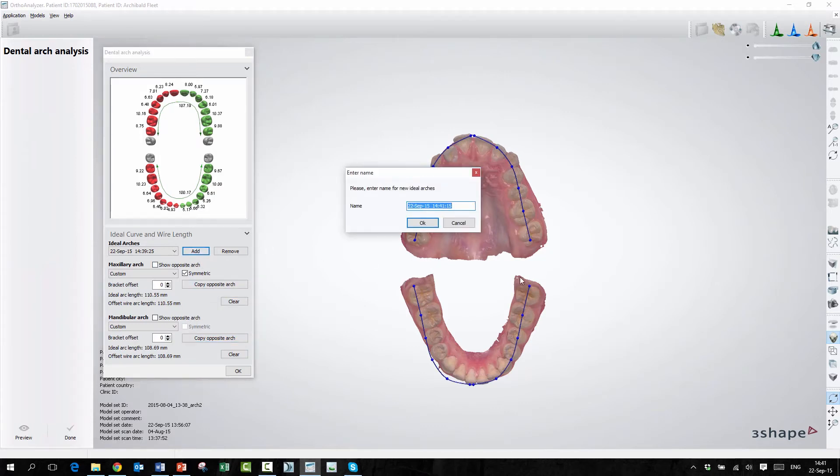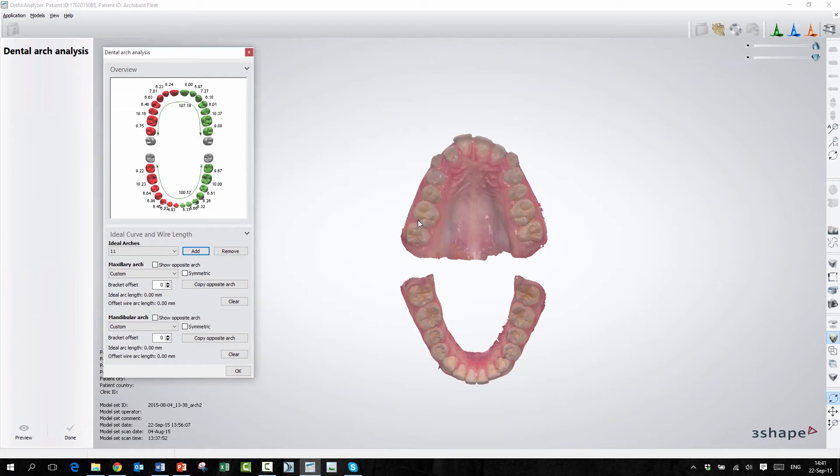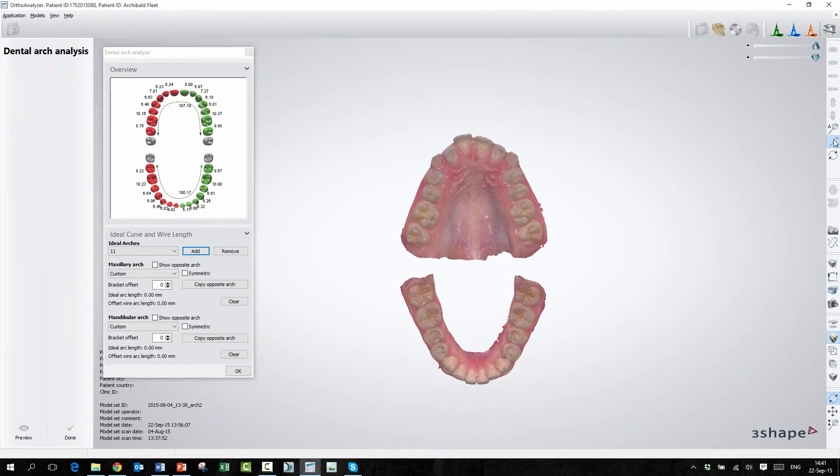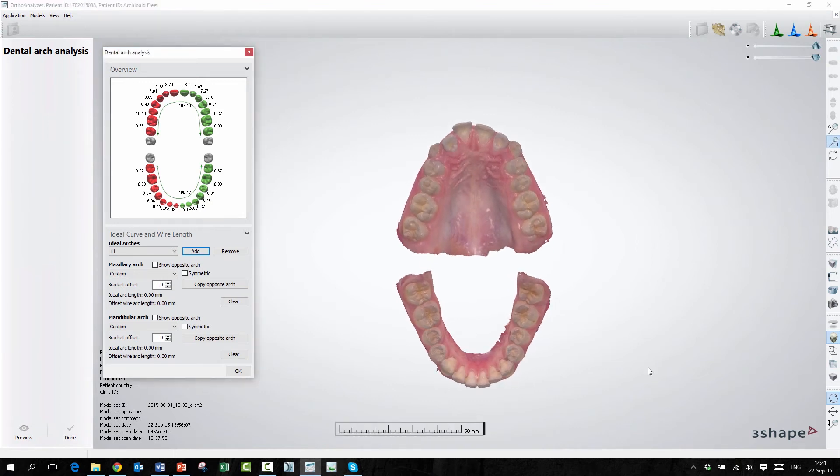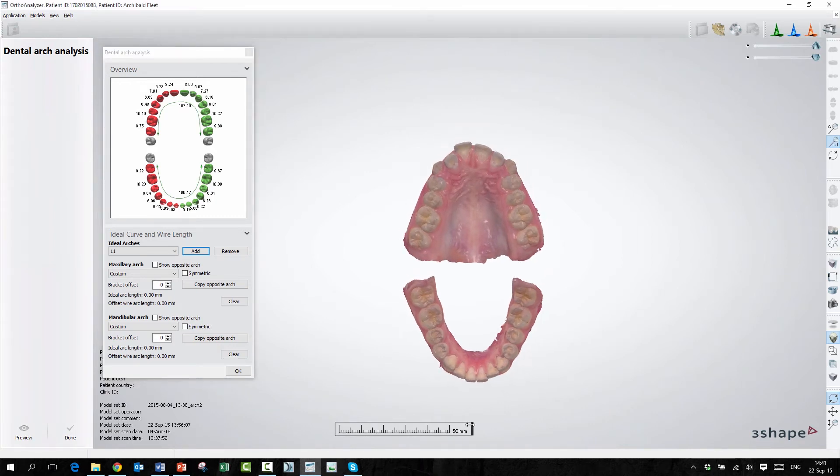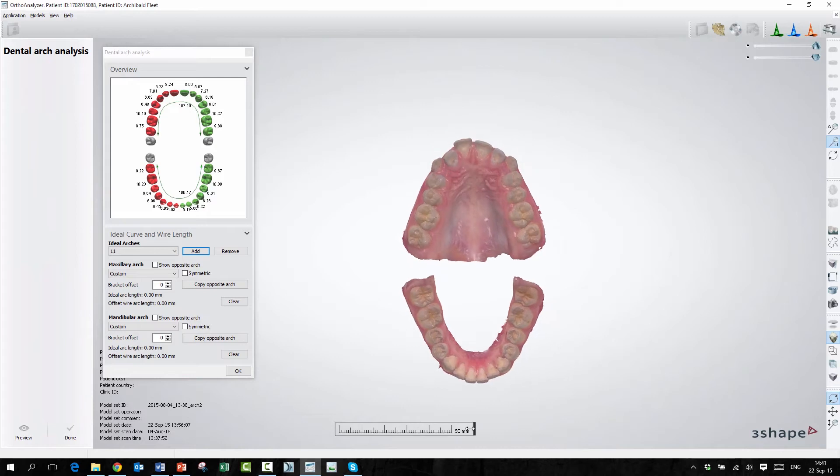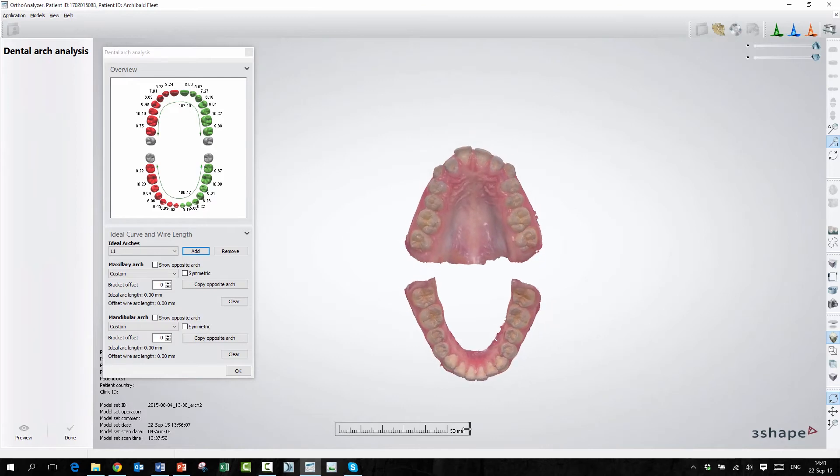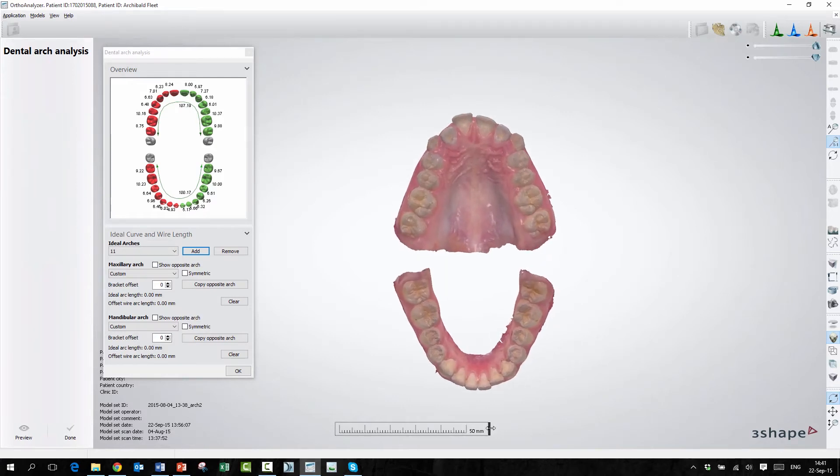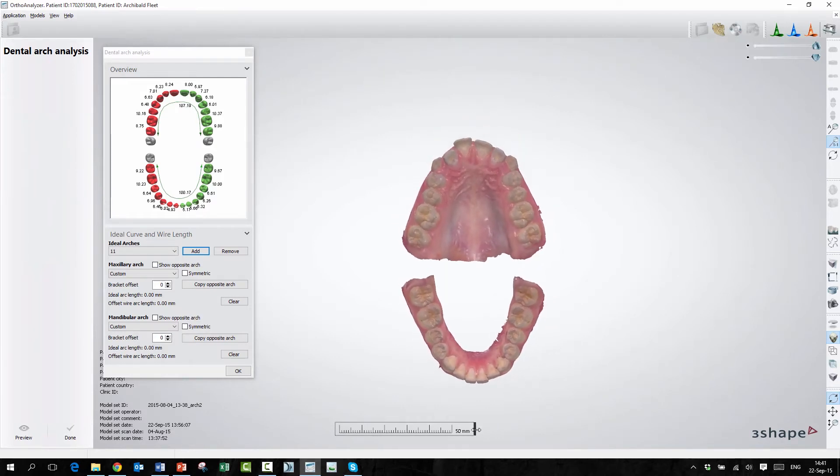And now I will just call it number 11. Over here, you can see at this point, it says Real Scale View. If I choose Real Scale View, you can see down here, we'll have a small ruler coming up. And by pulling this black marker here, you can actually go in and find the exact size.